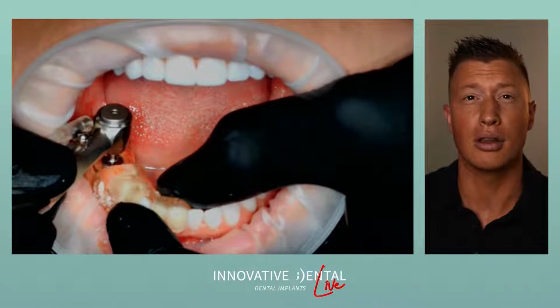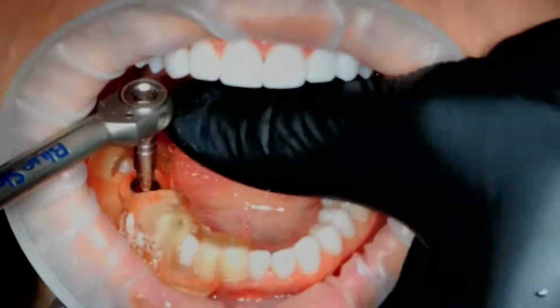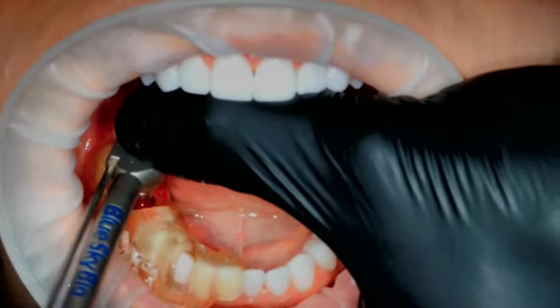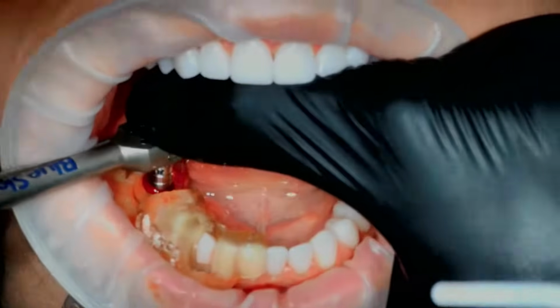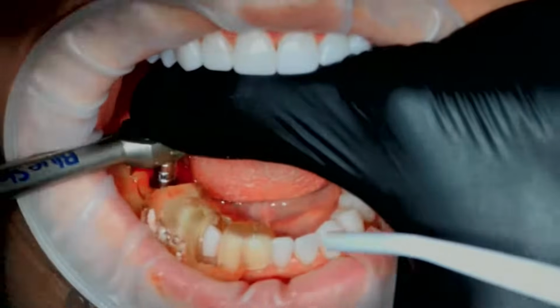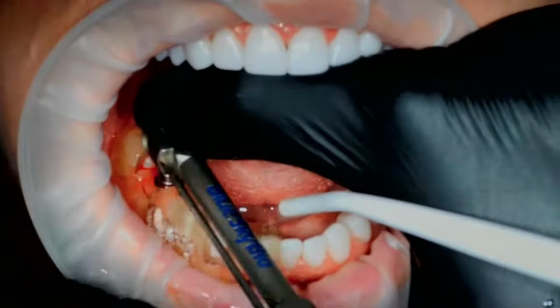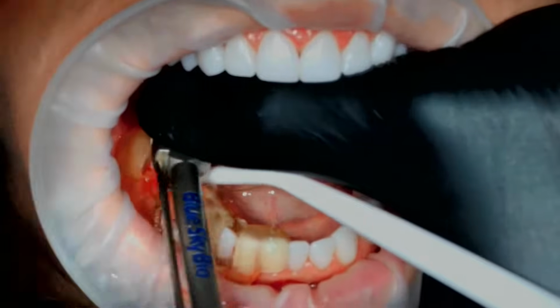If we graft it, I'm going to maybe wait a little bit longer. But there I am driving the implant in place. A little more clear shot this time of how that works. And then finishing it up with something that's a little more tactile. Placing an implant with a handpiece with a motor is different than placing it with your hands. And so I like the feel of knowing how much resistance I'm getting. We want the implant to have some pretty decent torque so it doesn't move around and has some good initial stability.